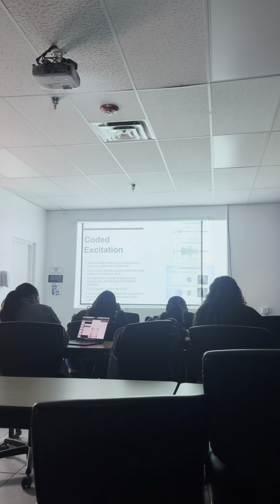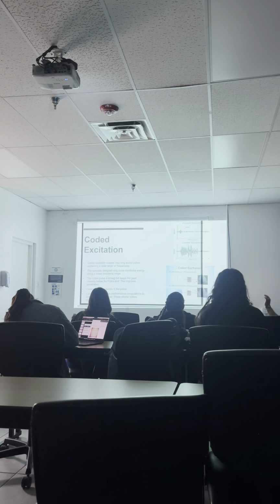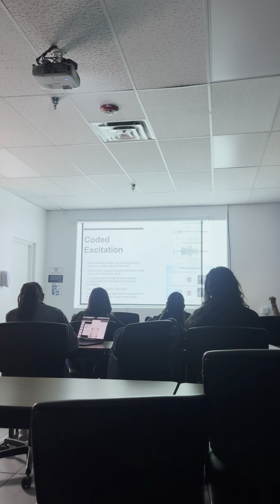Coded excitation. Everybody has problems with this. Okay, so what are we constantly trying to do in ultrasound when we're scanning our patients? Adjusting the image to make it what? Better resolution, okay? With each image, with each structure, we're optimizing our images to make an accurate diagnosis, right? So we can say that we're trying to improve resolution to be more accurate.